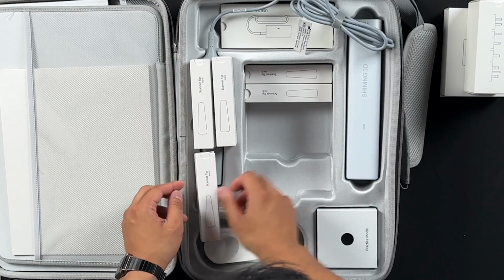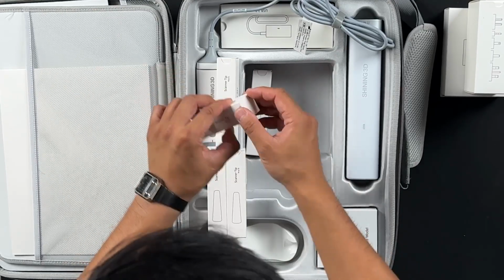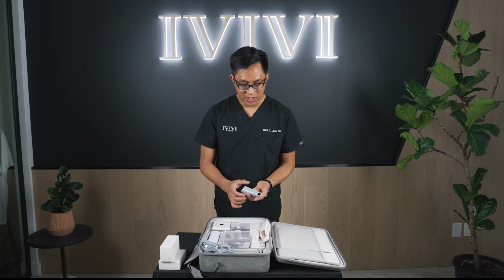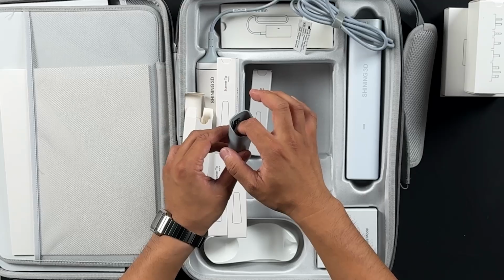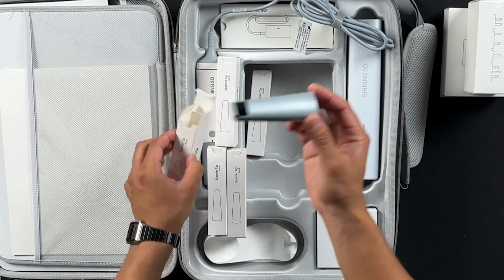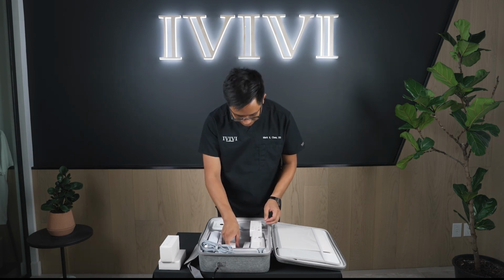And then we have the tips. It comes with 5 tips, 4 large tips and 1 small tip. I'll show you one of the tips here. This is the part where the image is captured. We have a mirror there, and these are autoclavable up to 100 times. The heating pad that keeps it anti-fog is in there. We'll get into the sterilization protocol for these tips later on in our demo video, but for now we'll move on to the next tip.